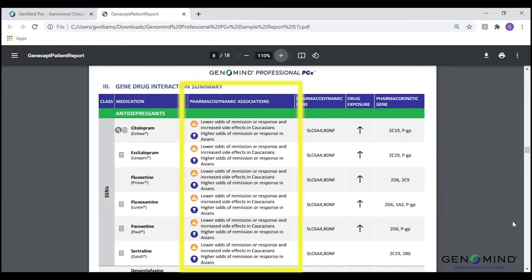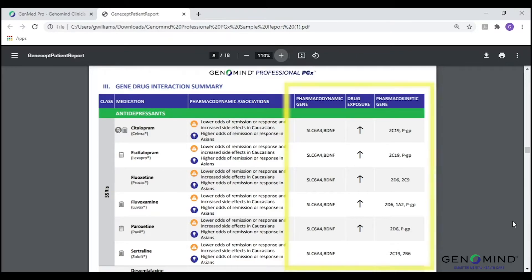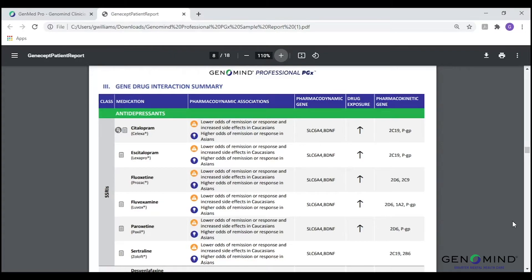In the next columns, you will see a concise overview of any pharmacodynamic-based information for a particular medication, as well as the gene or genes associated with this information. Finally, the right side of the page highlights the pharmacokinetic pathways associated with each medication, as well as the drug exposure column, which highlights changes in blood or brain concentrations of the medication based on a patient's pharmacokinetic genes.